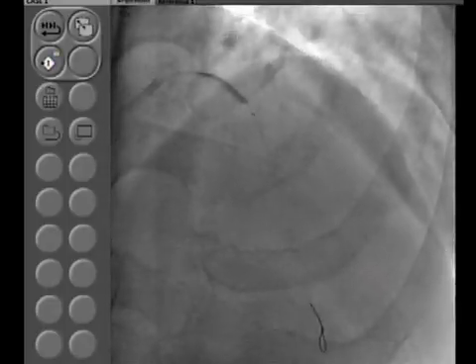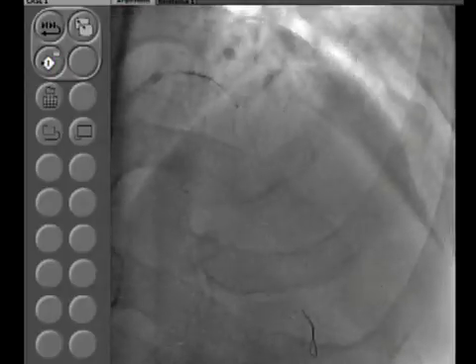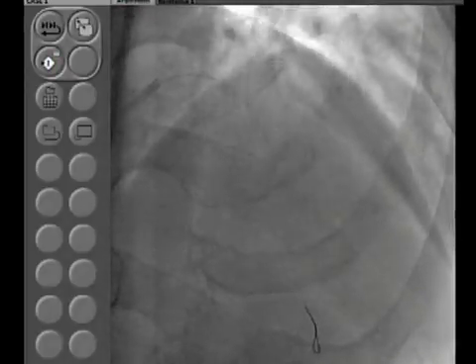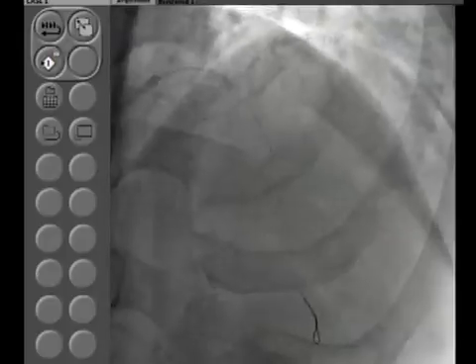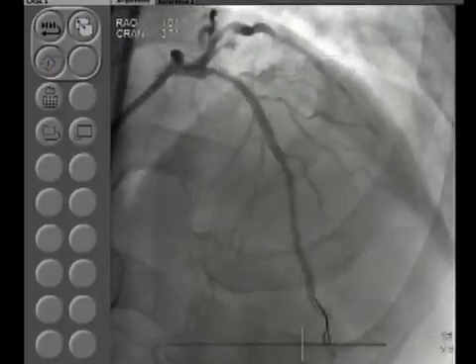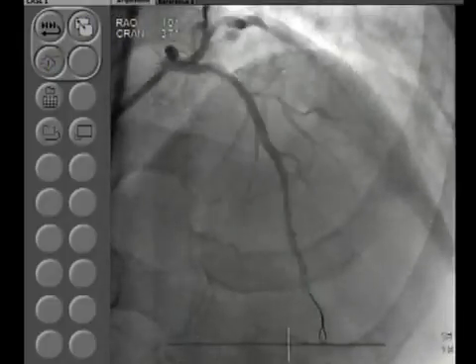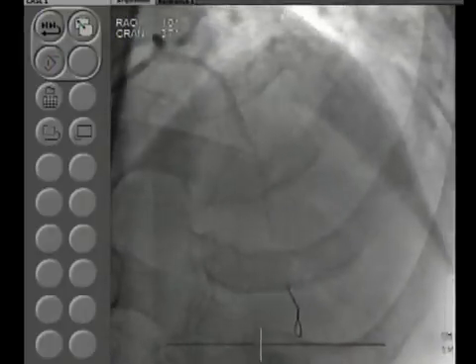Remove the burr, please, because once you are done, remove it from the table so that the area will be clear. Take a picture. Good. And also, Samir, 28? 28, yeah. That will cover it, the 23 is good.